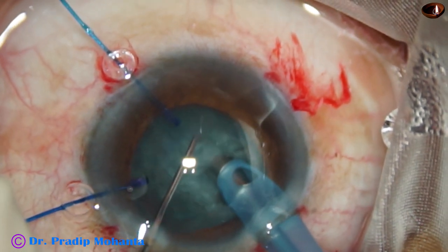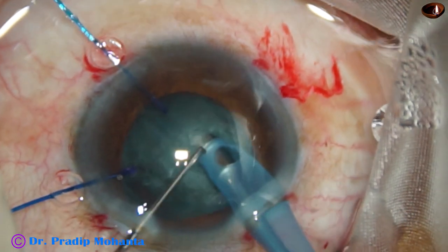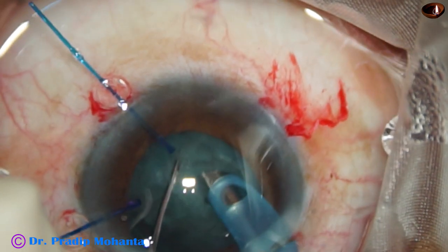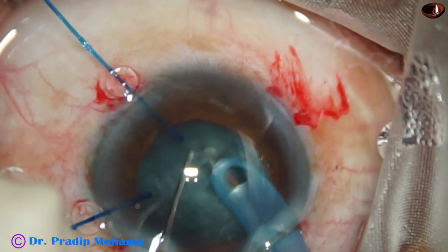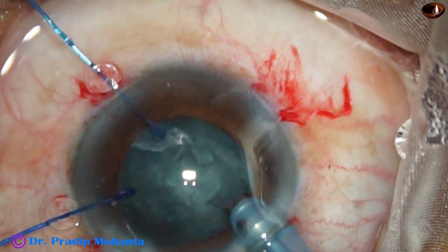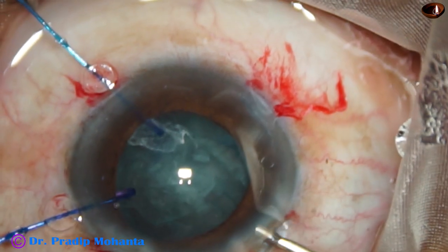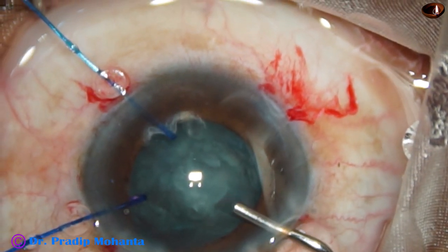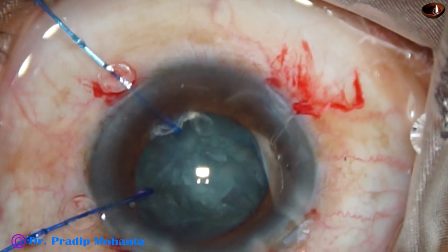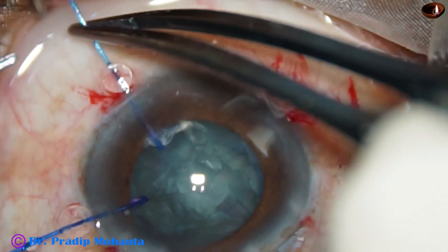I turn the tip of the phaco needle towards the right, towards 7 o'clock, and try to make another chop — but this was not a good crack. At this time, I find some more vitreous strands coming out from 4 o'clock.